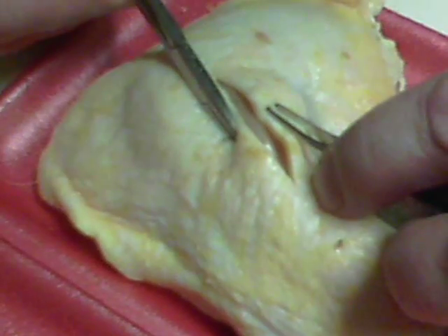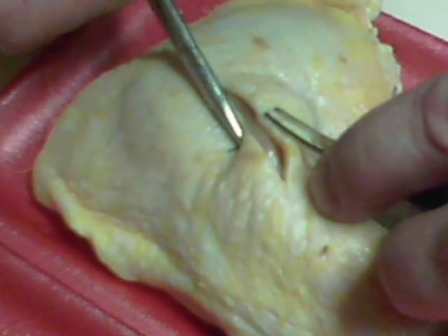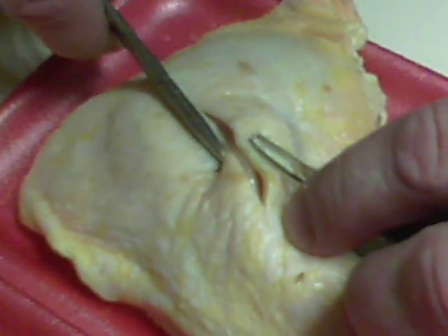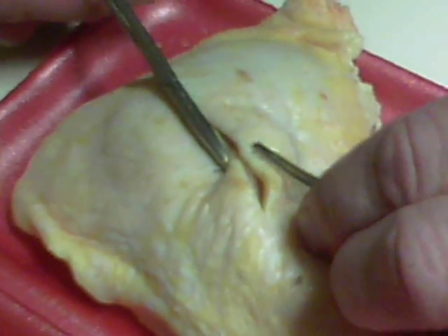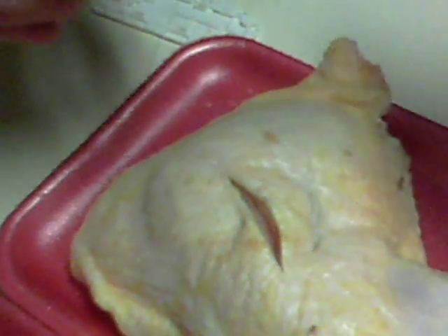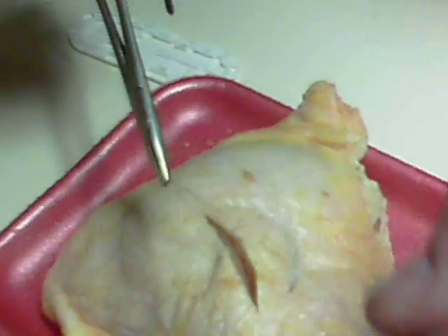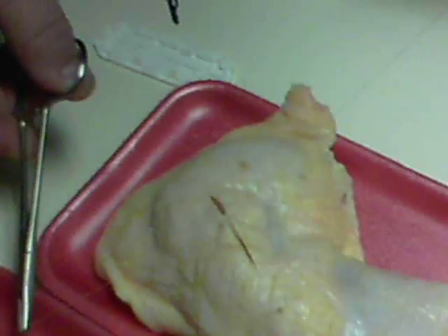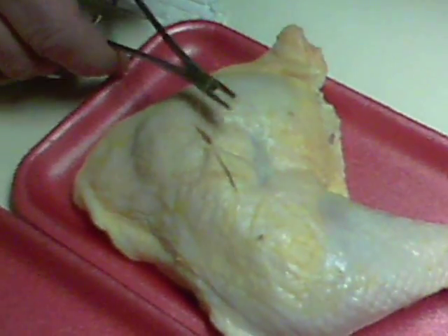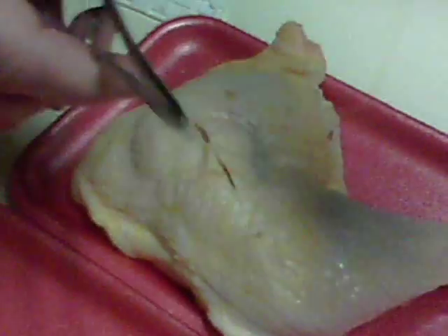Find the same spot on the other side. About right. So then you pull it on through — that part's what's in the magazine, this is the part that's not. You take it, you grab this, and you go around this about three times. Like that. Then you grab that end like that and you just pull it on together. Like so.